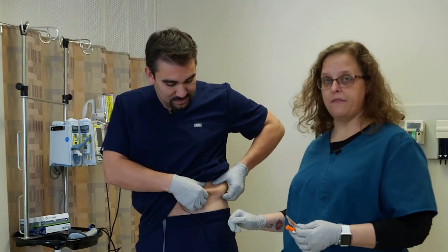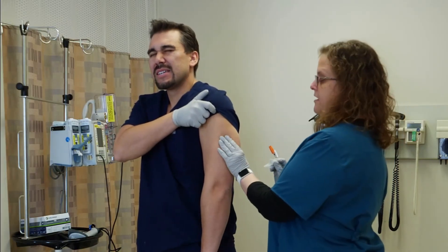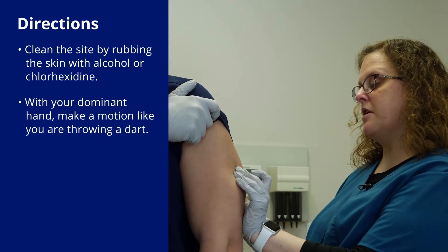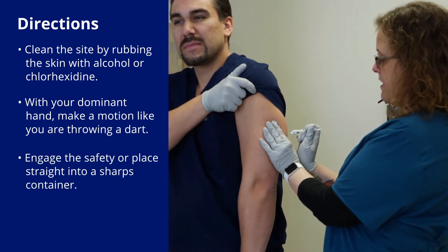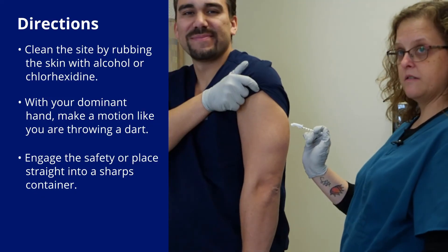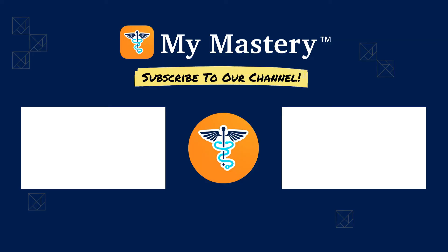Even your very thinnest patients are going to have some love handle meat. So if you're struggling to pinch an inch on super thin patients, everybody has something at the love handle. For demonstration, I'm just going to stick Mike in the back of his arm. I'm going to wipe here, and I'm pinching just a little bit so I know where I'm going — I'm not taking my eyes off it. Then I'm going to dart in, push in, and engage my safety. Just like a dart, you go right in and it's all over before you know it.